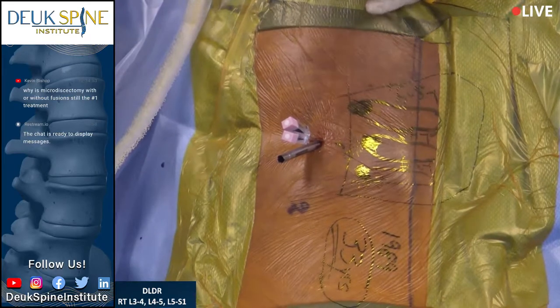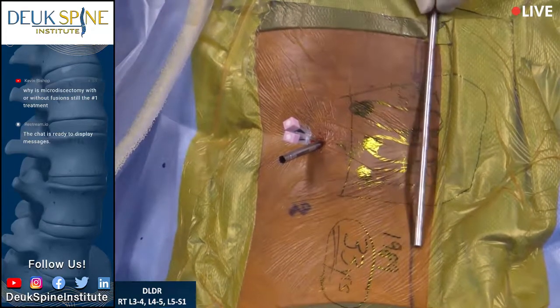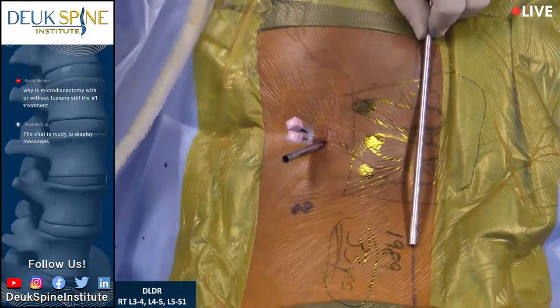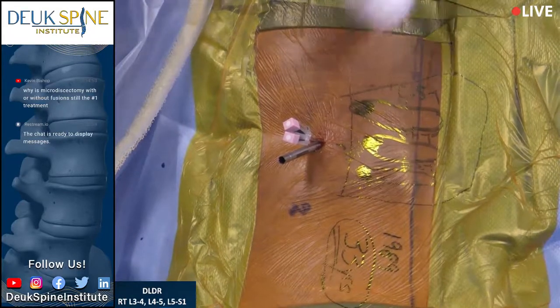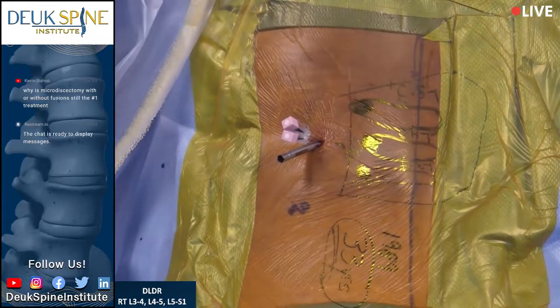If we were doing a fusion, the incision, you see this metal rod? The incision would literally be this long, about 10 inches, right in the middle. And we would be ripping out bones and ligaments to do the fusion, along with putting in screws and cages. Instead, we're doing the entire surgery through a tiny little cut to the side.